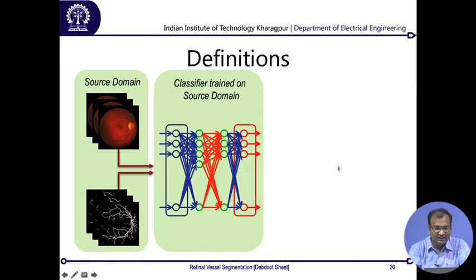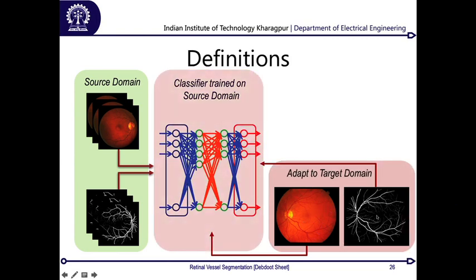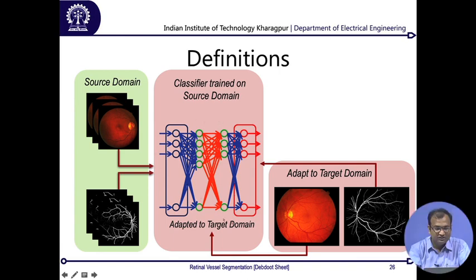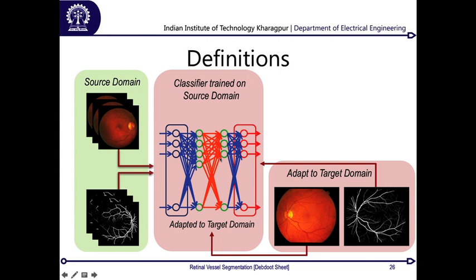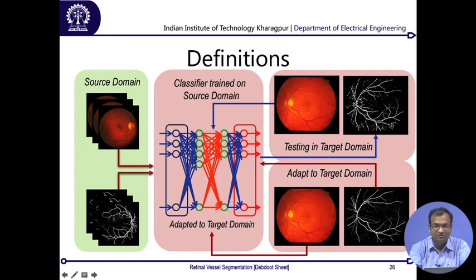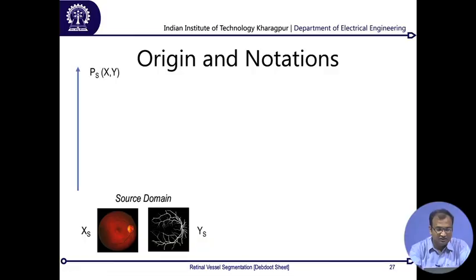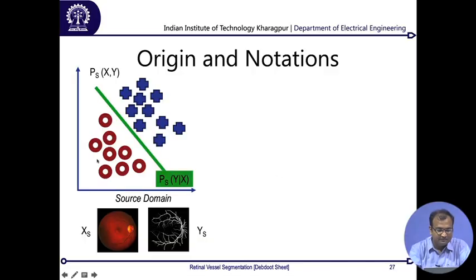From there, the idea is that the moment you would like to do an adaptation, we have to take the image and the ground truth of the target domain, and then feed all of this information via some sort of an adaptation algorithm, which is another level up of a learning algorithm itself, into this network, such that it gets adapted. And once it's adapted, then you would see that you get perfect results on your segmentations in the target domain as well.